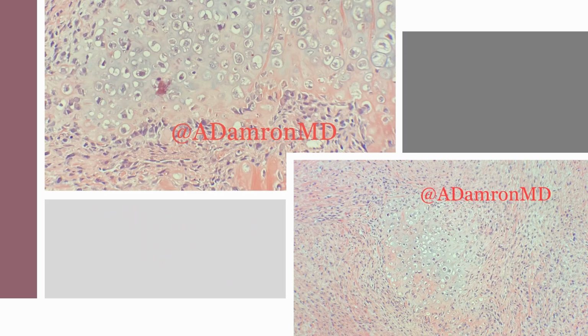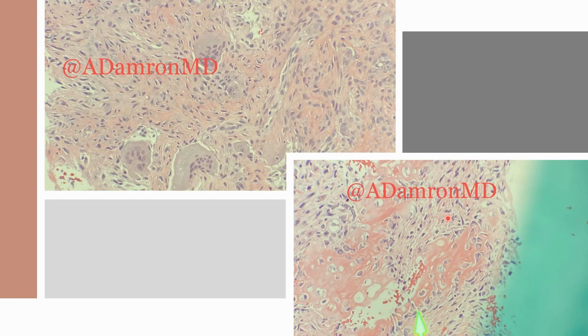Other things that you can see, this was a case that I had shown on Twitter, so my handle's there, but this was a case I had that was a malignant phyllodes tumor that had chondrosarcoma in it. You can see in these low power images, hypercellular, chondroid tissue here, certainly highly atypical stroma. This was an example of chondrosarcoma inside of a malignant phyllodes tumor. The same case that had malignant cartilaginous differentiation in it also had malignant bone formation or osteosarcoma inside of it.